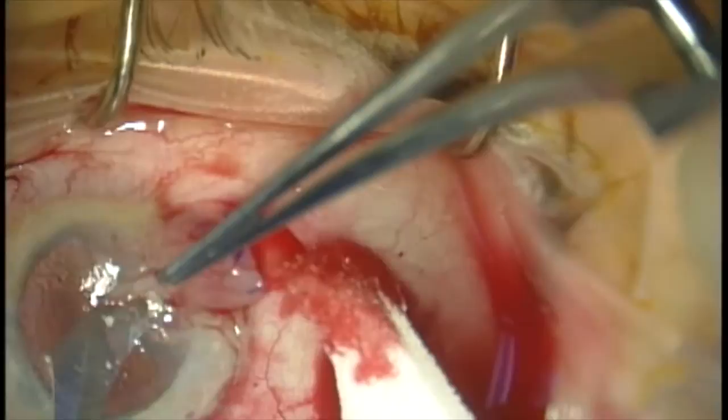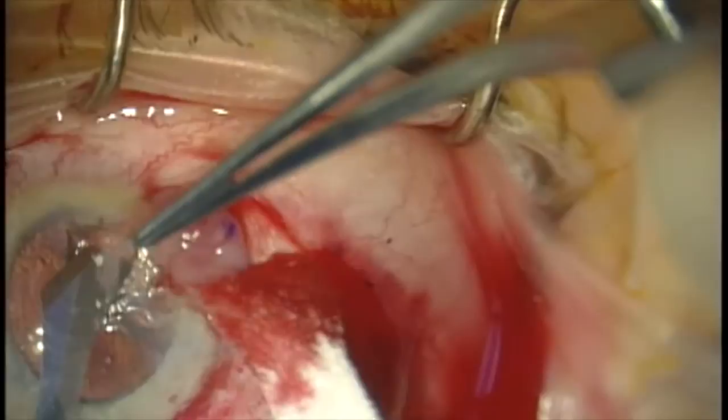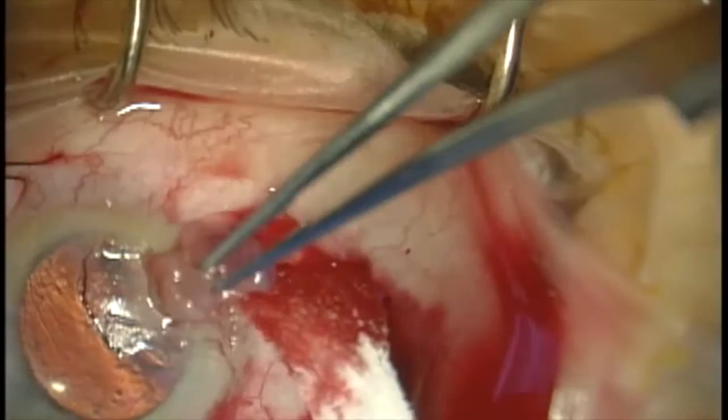Now we're dissecting the head of the pterygium. I like to grasp the head with a toothed forceps and pull it away from the eye, then use a number 57 blade to gently dissect at the level of Bowman's. Doing this prevents going too deep and creating irregular astigmatism.